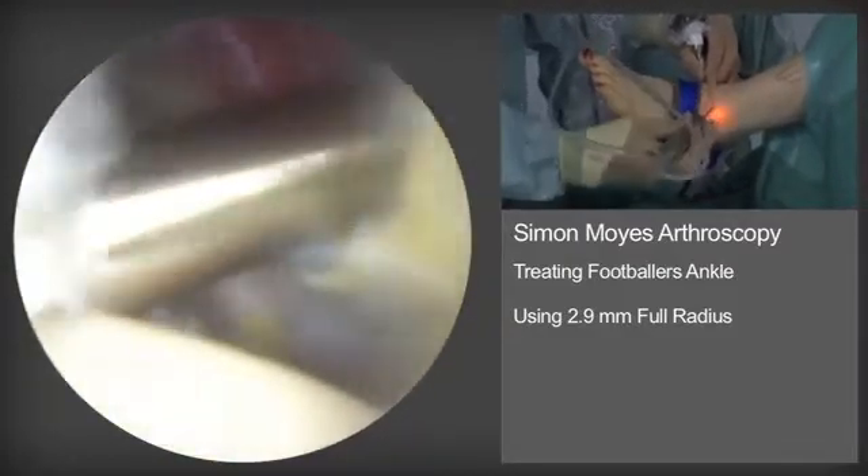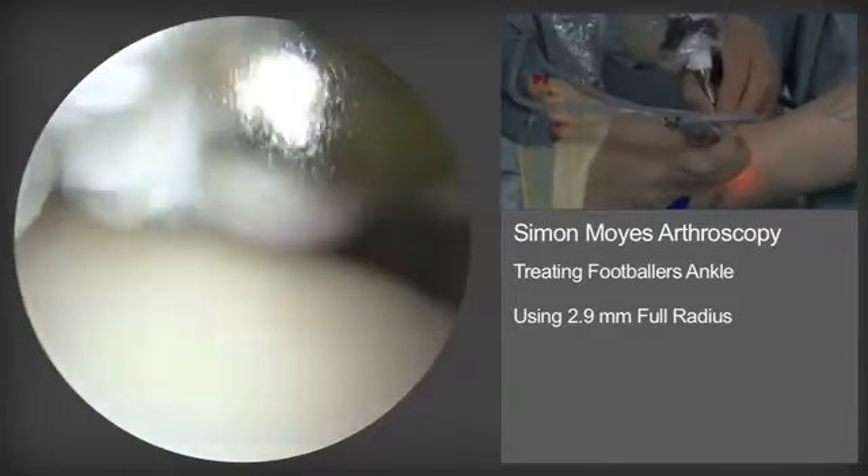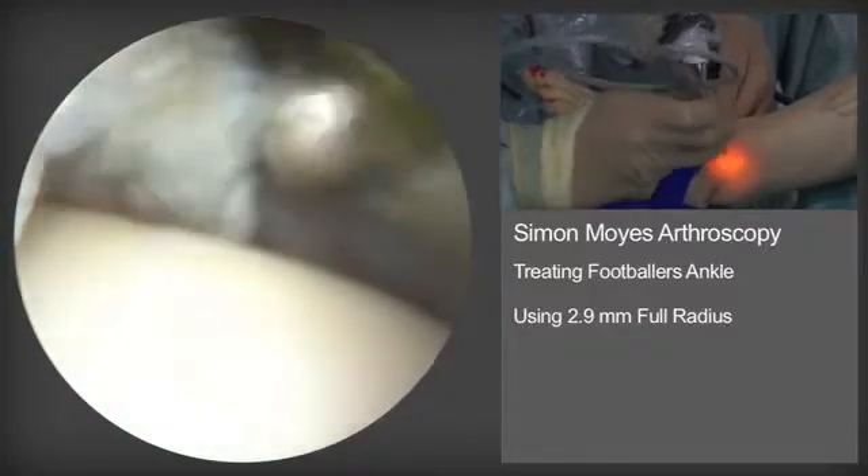The talar dome is beneath us. The distal tibia is at approximately 10 o'clock on the arthroscopic screen.